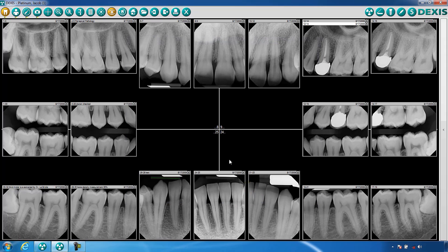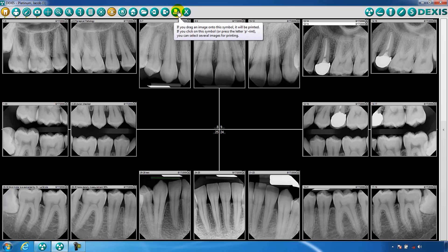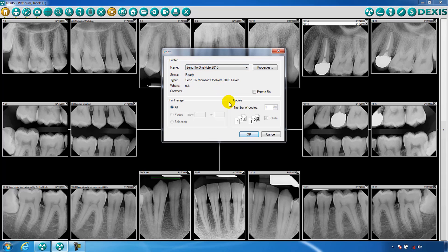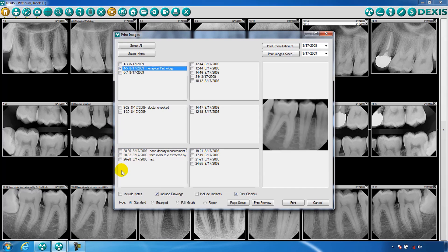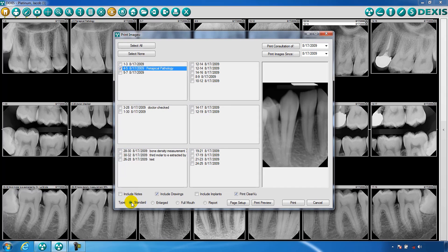Printing, much like the export function, allows you to select the images that you would like to print and gives you a variety of options: standard print, enlarge print, full mouth print, and print a report. You could also print a preview.